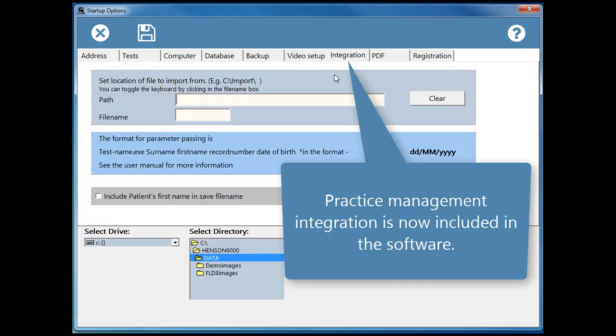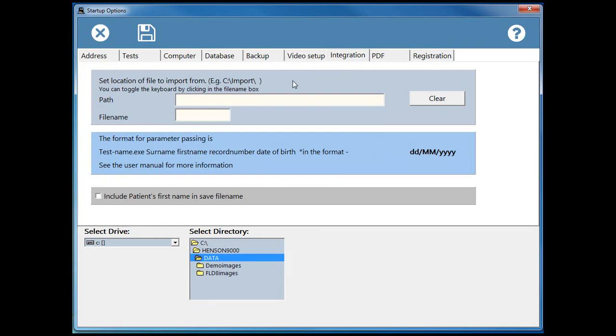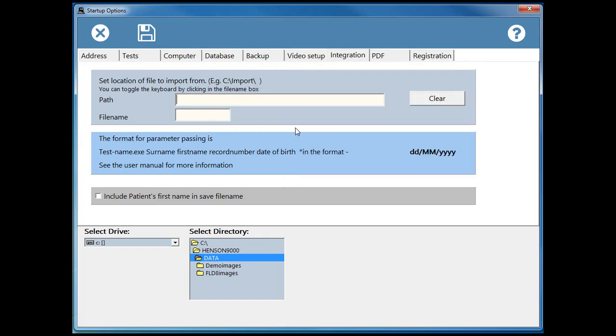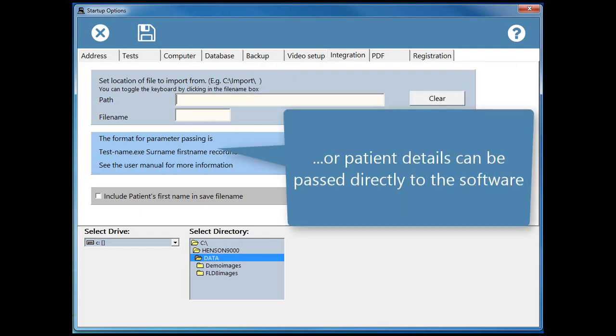Practice management integration is now included in the software. The software can import from a network based text file or patient details can be passed directly to the software.